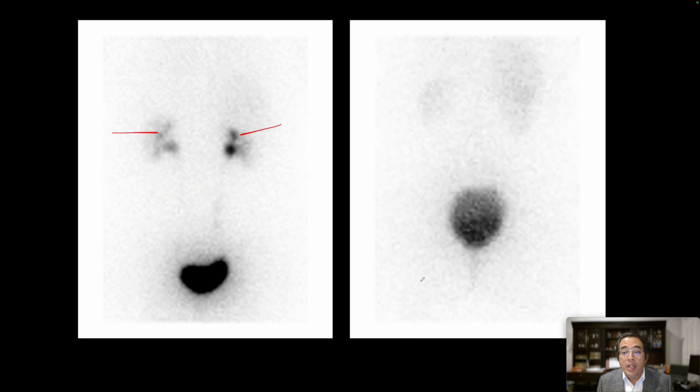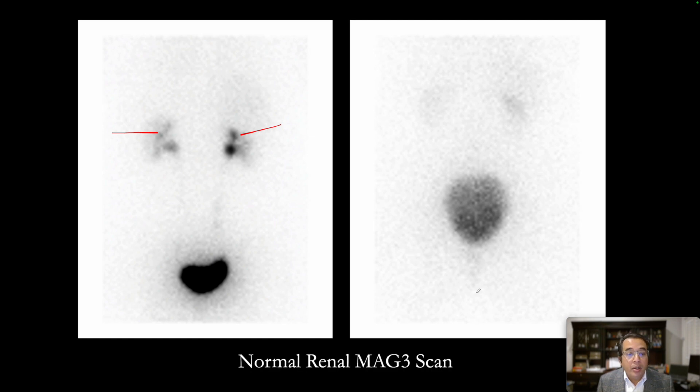And so these are the post-Lasix images showing that after the administration of Lasix, both kidneys are forced to excrete the radiopharmaceutical into the urinary bladder. So this is a normal renal scan using technetium 99M MAG-3.